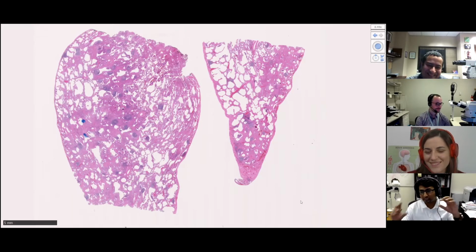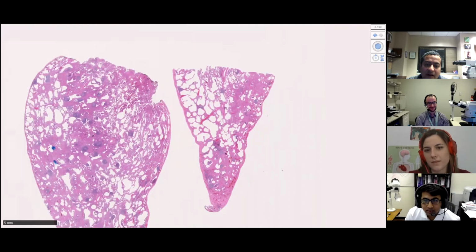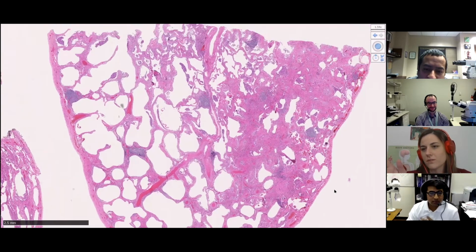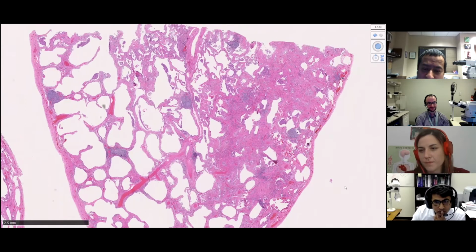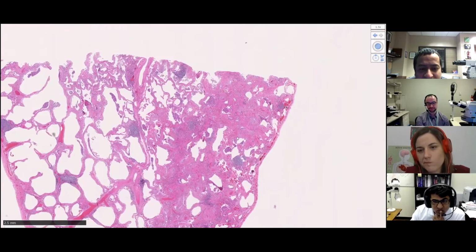So let me show you the same low mag of the middle lobe and lower lobe also. That's why I asked. Sorry, one question for you. This right side is not destructuration? In the small piece, the right side has somehow lost its structure a little bit. Yes, that's a good question, Irene. So you're asking, is that scarring or not, or architectural distortion? I would be doubtful. Yes, it's doubtful. I don't think it's completely lost yet, the architecture.